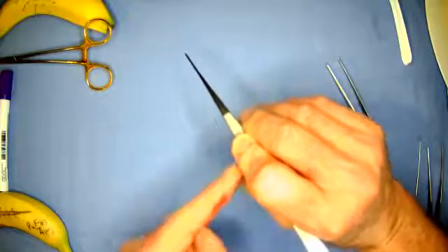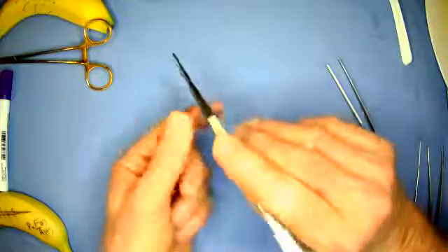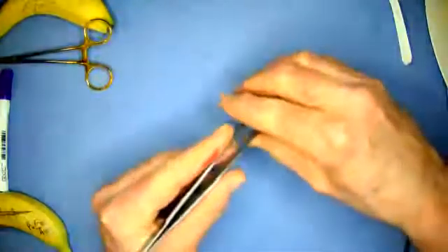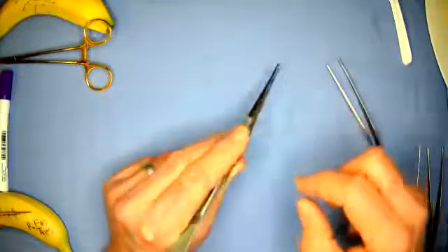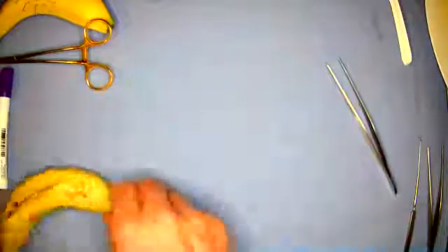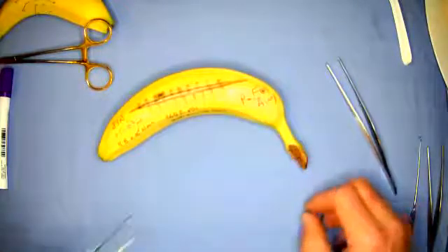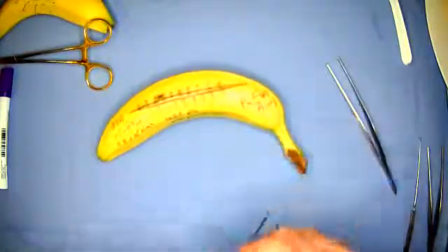So when I'm watching trainees operate, I'm watching for that blanching of the finger and correcting the position. So your finger is extended down the forceps and applied, and you won't see any blanching. So there's a little physics here for you. All right? Some say it's not in the back of a cigarette packet, but this is physics on a banana.